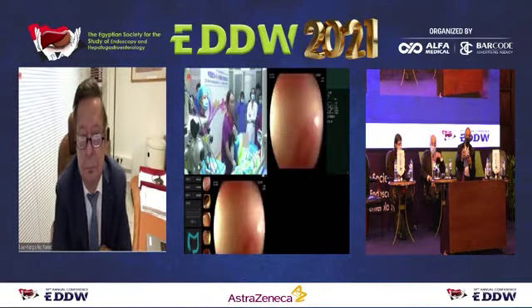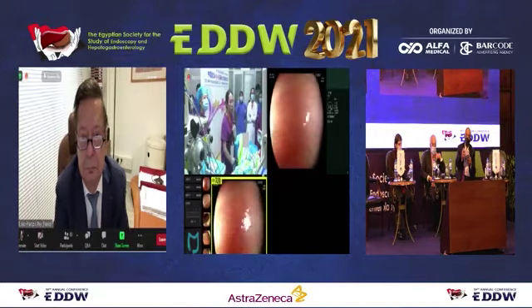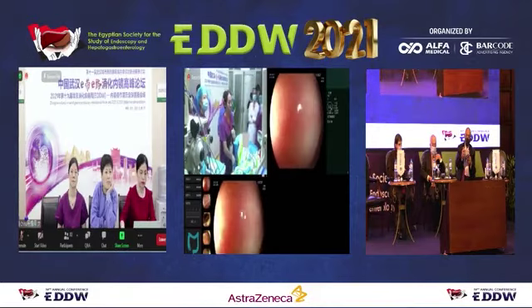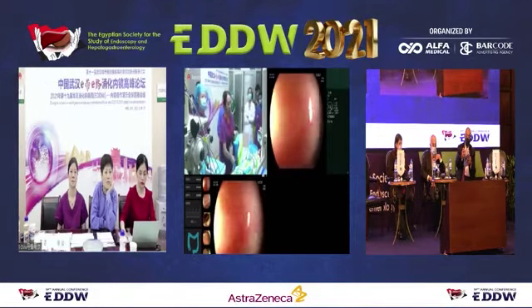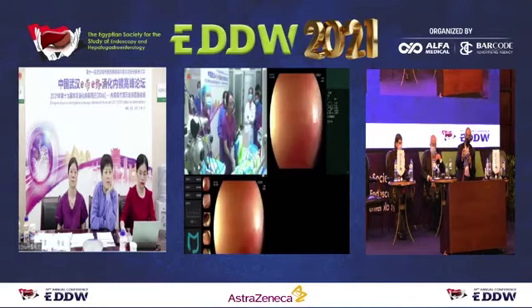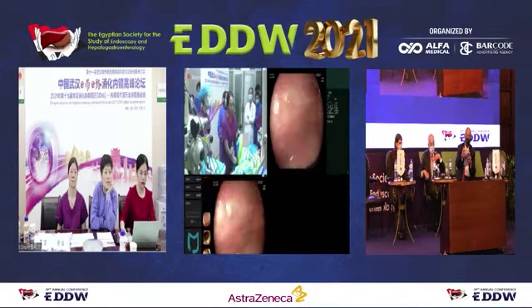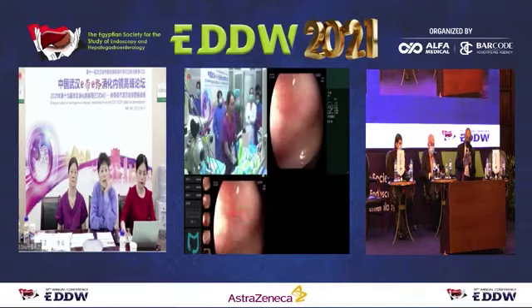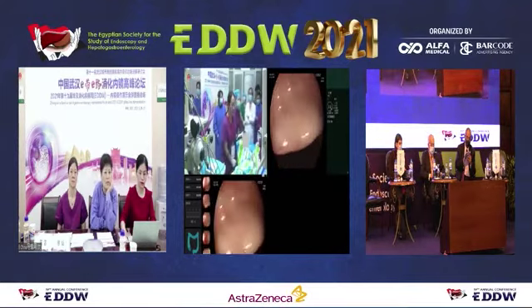If the patient has some bleeding in the colon, or for old people, when we withdraw the scope, sometimes we use BLI or NBI, especially when you detect some lesions.